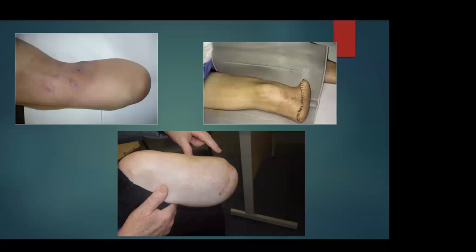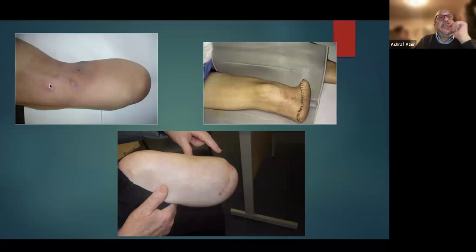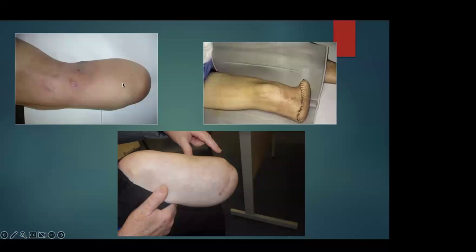Overfitting. Valgus knee. She's lying on her tummy. How can you comment on valgus knee here? In her tummy. Oh, this is the back, sorry. The stump is quite bulky distally, so that leads to pressure proximally, I believe, when she sits, and causes the pressure sore.